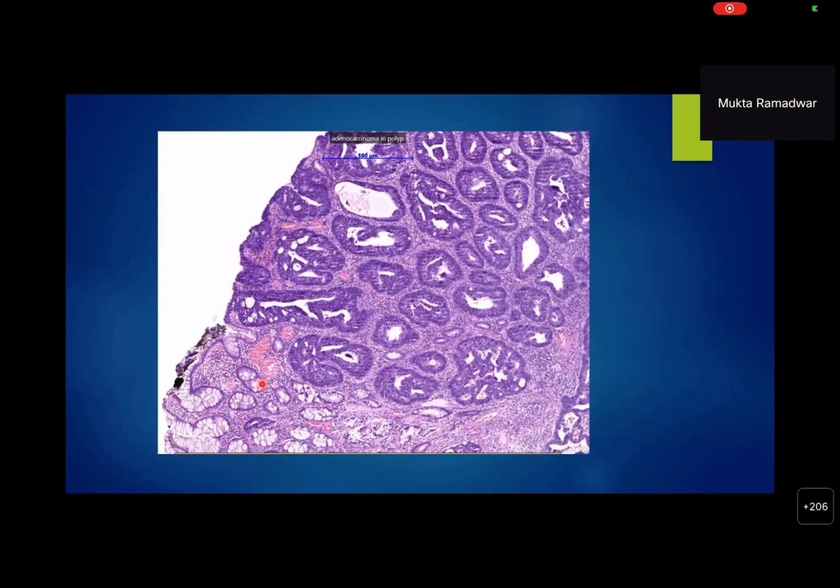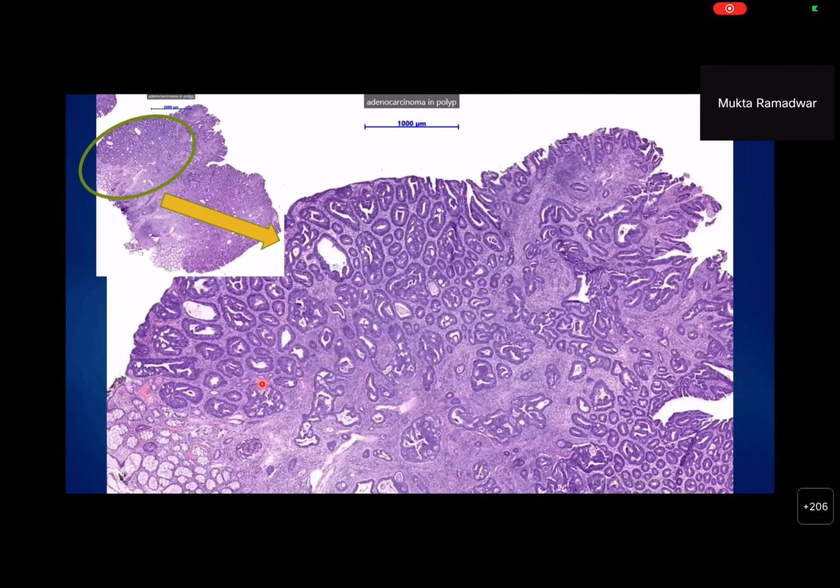Can you see atypia? I cannot see. All I can see is the description that you just made of the architecture, and all I can say is it's very blue looking compared to the adjacent epithelium. I need to go on higher magnification now for further assessment of the nuclei properly. Okay. Now I'm magnifying this portion of the polyp here for you. What can you see here? Again, ma'am, there are areas of normal colonic mucosal glands, and predominant areas of glands with complex architectural atypia, with a few glands showing dilatation and elongation along with angulation. Correct, and very blue looking.